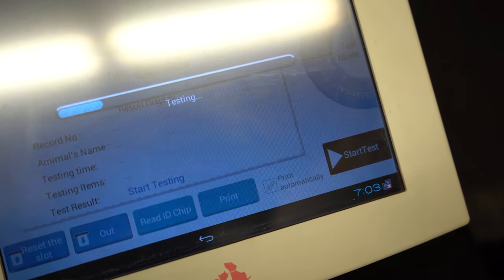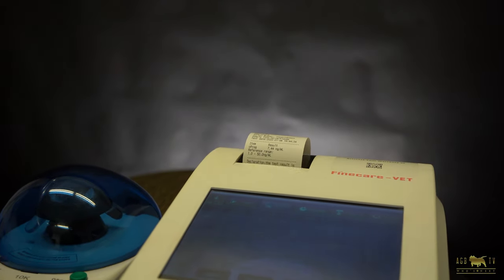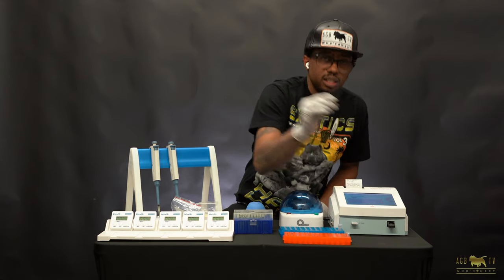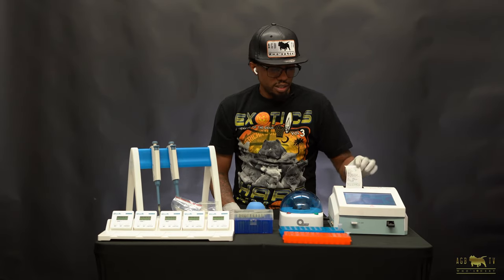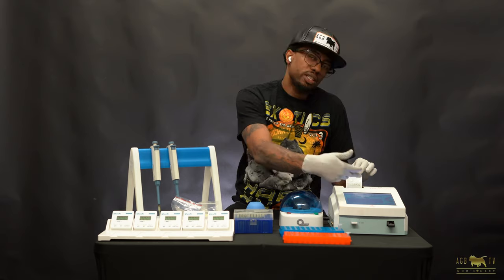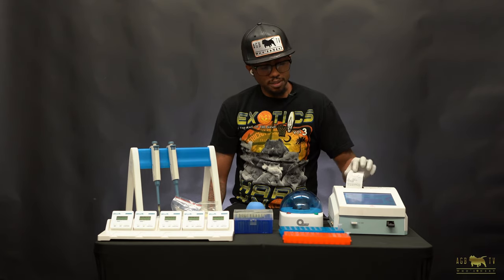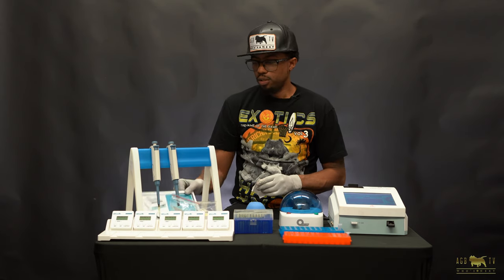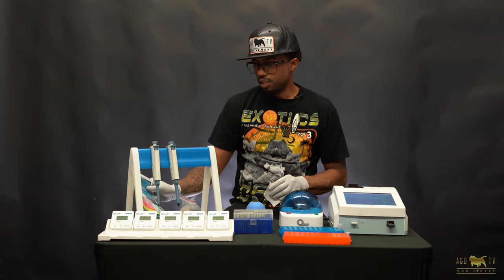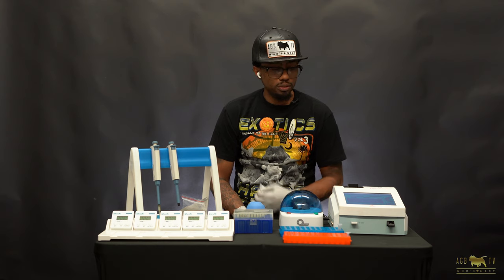Now that the test is done, take out the cartridge and dispose of it so you don't get it mixed up with anything else, then read the results. The results are printed on the screen and can also be printed out on a sheet, which is great. You can then take that sheet and compare it against the progesterone timing chart to see where your dog falls. And that's how you run a progesterone test with the Wunfo Fine Care.